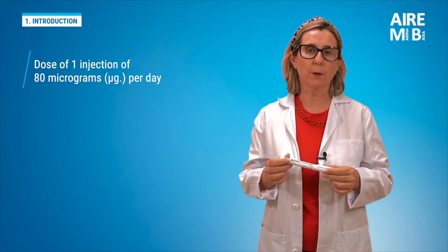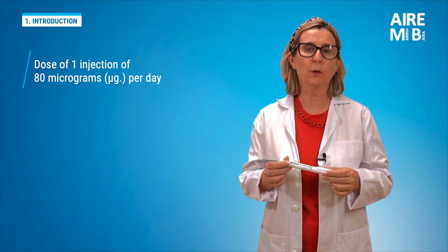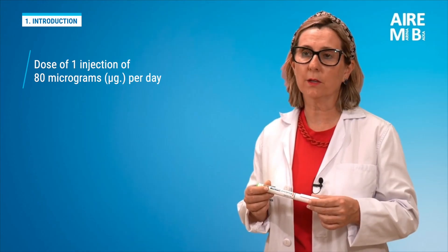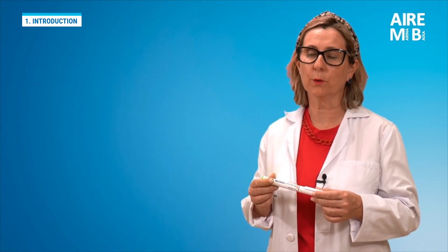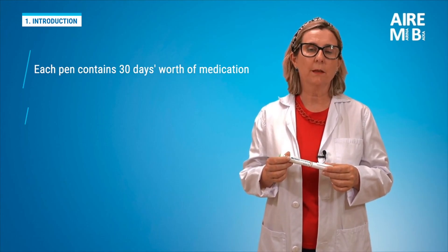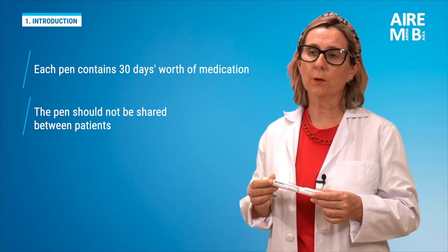The recommended dose is 80 micrograms, administered once a day via an injection under the skin — that is, a subcutaneous injection in the abdomen. It is presented in a pre-filled pen that contains medication for 30 days. Each pen should always be used for a single person.